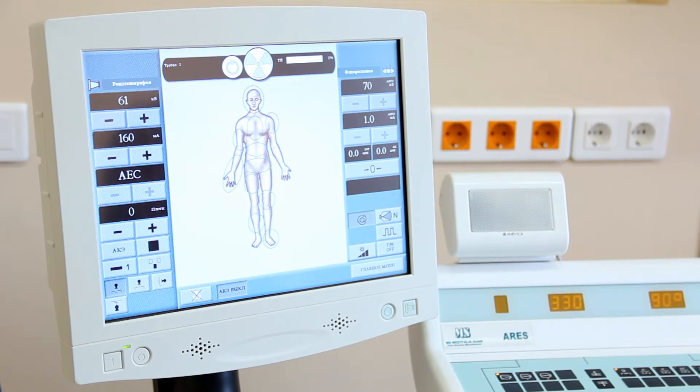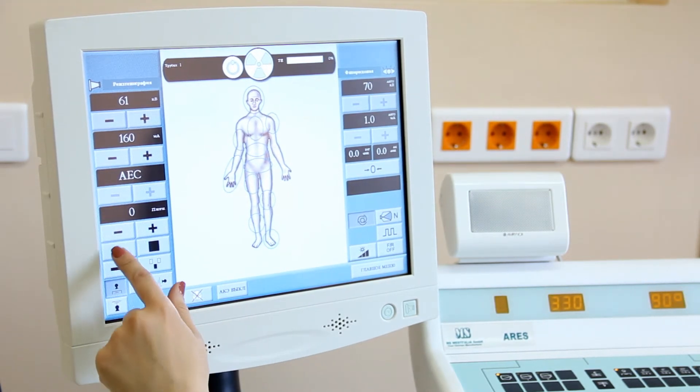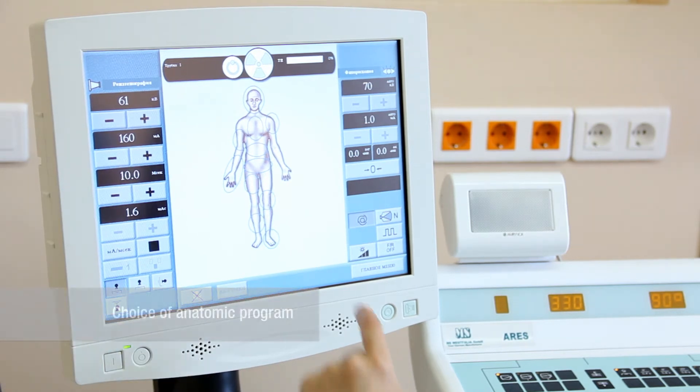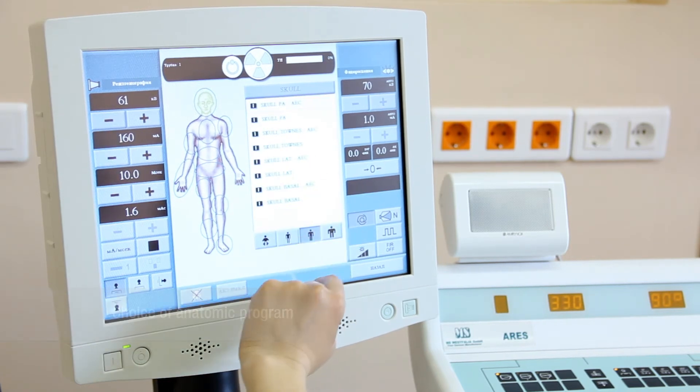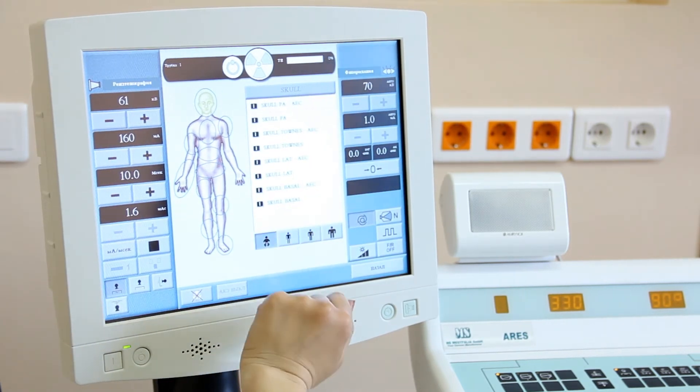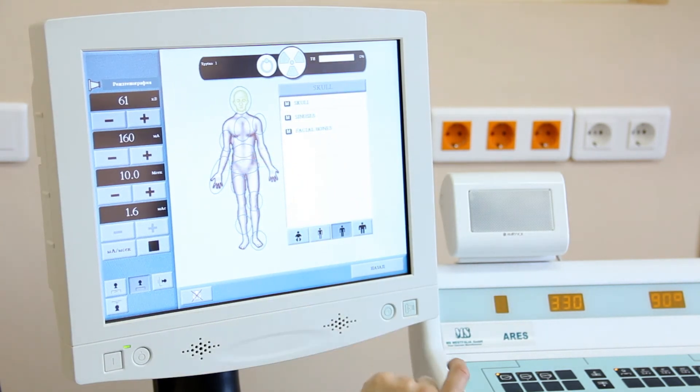Centrally located body scheme allows choosing necessary anatomic areas for screening. The age and body size differentiation option helps selecting optimal parameters for reducing radiation dose and saving image quality at the same time.